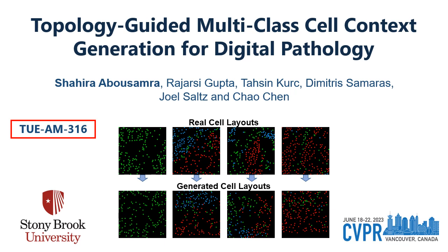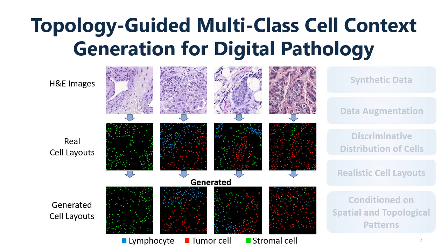I'm a PhD student at Stony Brook University and I'll be presenting our paper, Topology-Guided Multi-Class Cell Context Generation for Digital Pathology. Pathology data annotations are limited, mostly because they can only be collected through experts. In this work, we propose a method to generate synthetic data that can be used for data augmentation.